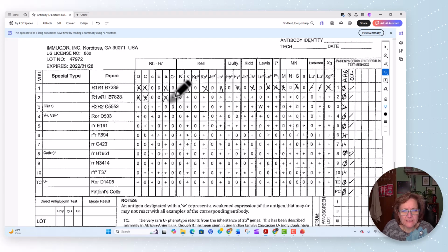If you're in my class, you know this one only has one allele, so it gets the double dose. It's zygosity indeterminate. If you're in my class, we've got a discussion coming up. If you've already been through the discussion and you're watching this thinking, I still don't get it, throw me an email. I will be happy to meet with you one-on-one and figure out where your struggles are. Let's find your struggles early so that when we are moving forward, you've got this in your back pocket.